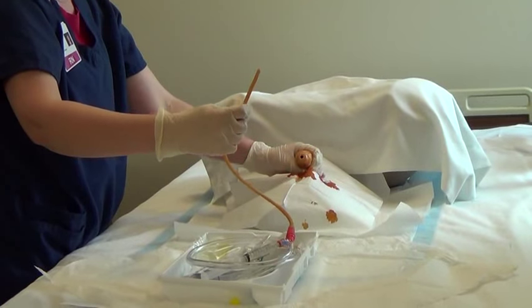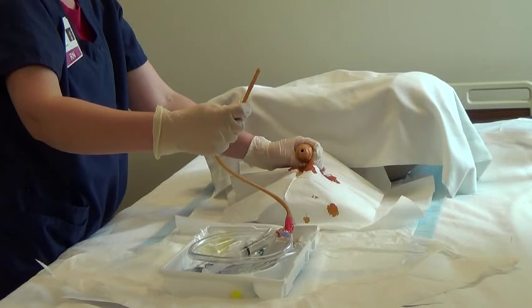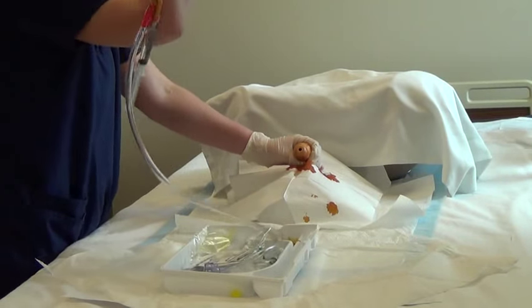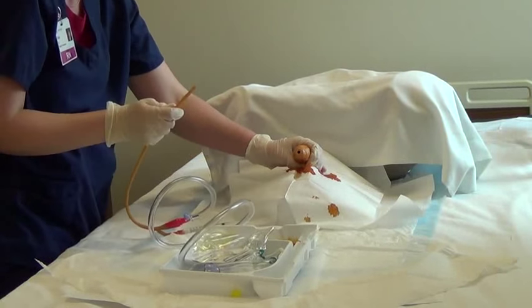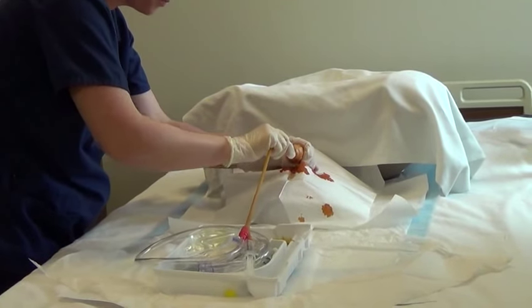During all these steps, the helpers can be assessing for aseptic technique. Watch us as we demonstrate some errors in insertion. Look for the catheter touching the inserter's arm or touching outside the sterile field. It is a common mistake for the inserter's finger to accidentally touch the meatus.